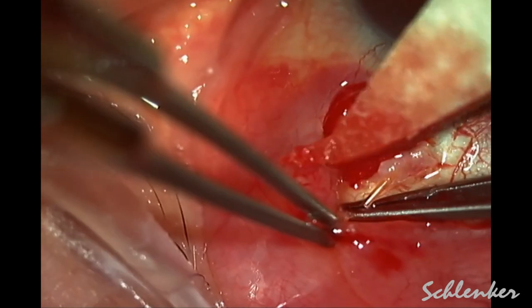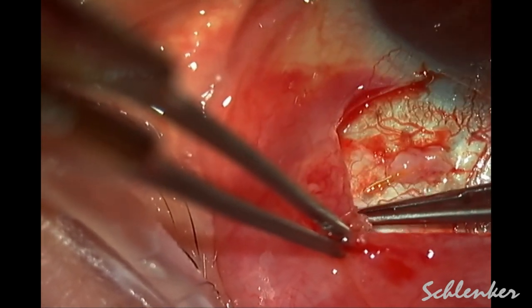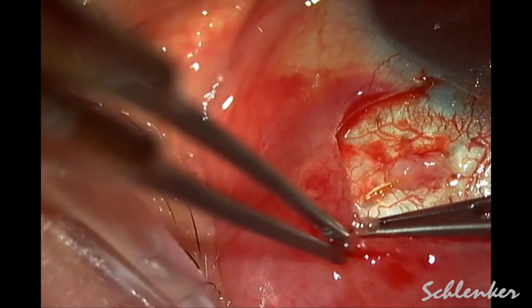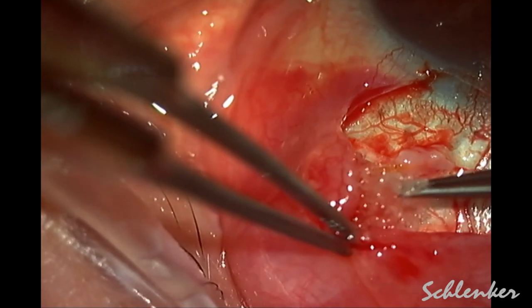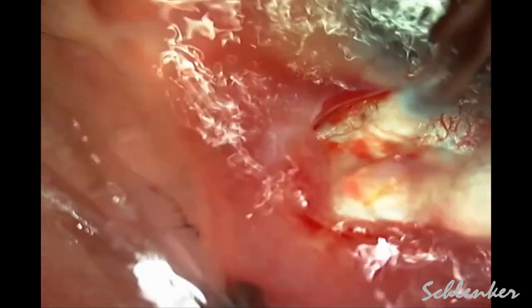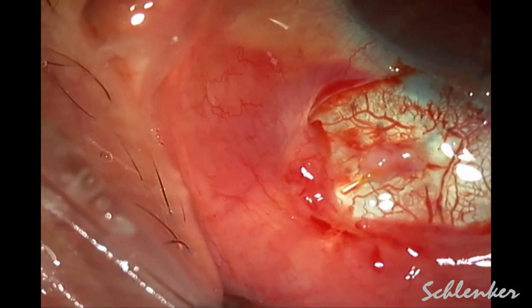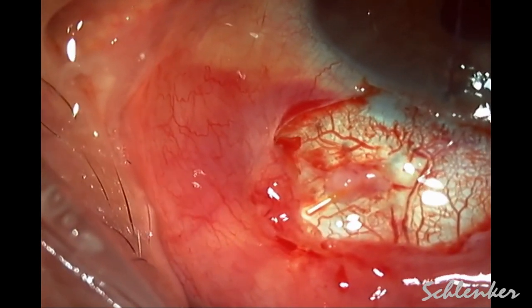Here we are placing mitomycin sponges. These have been soaked in 0.4 mg per cc mitomycin C, and I applied these for a period of two minutes.